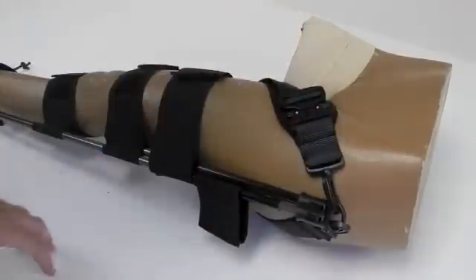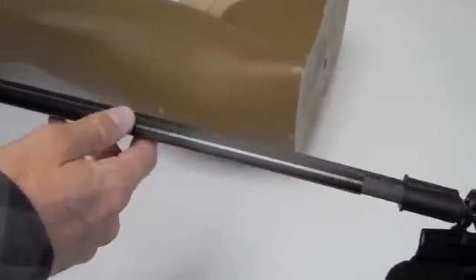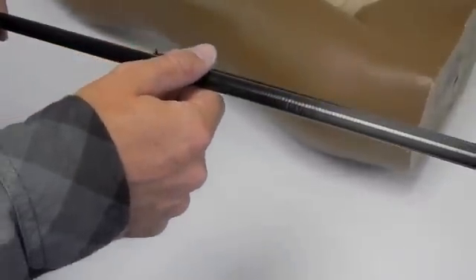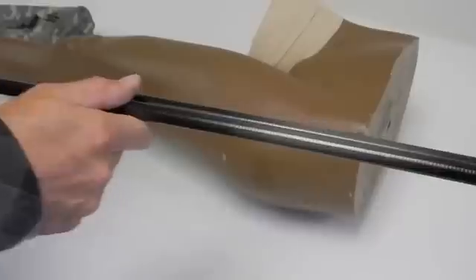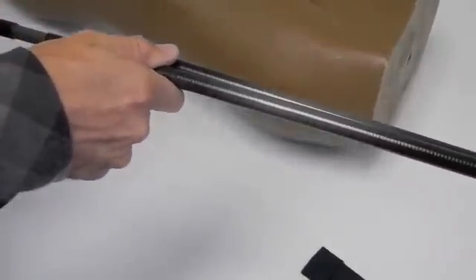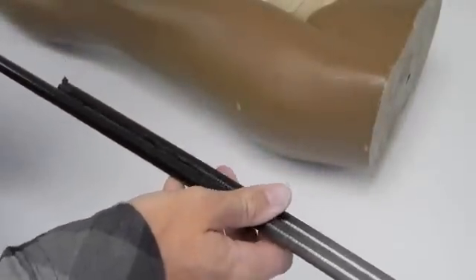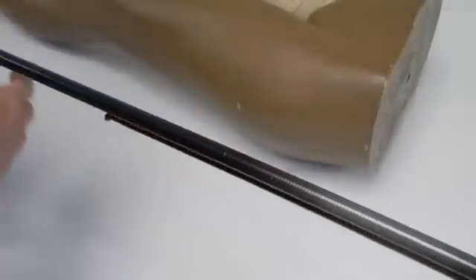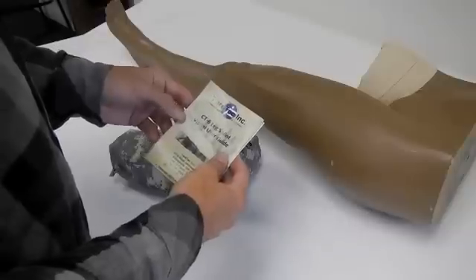Here we're looking at the carbon tubing of the CT6. This is centerless ground carbon fiber tubing. It has a nice coating of epoxy on it to prevent any splinters, and it also provides a nice grip so that the splint can be easily manipulated — held open and closed as needed. It can be cleaned with pretty much any standard cleaning supplies that are typically in use by medics.